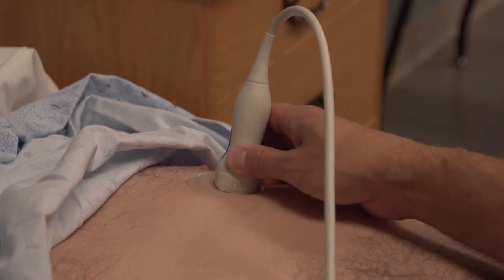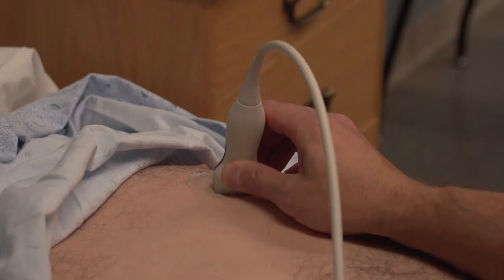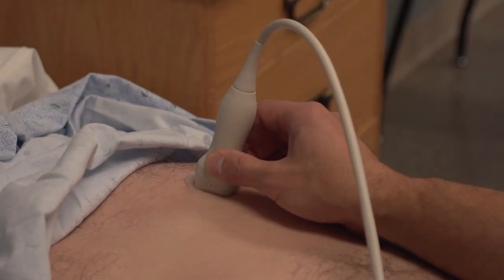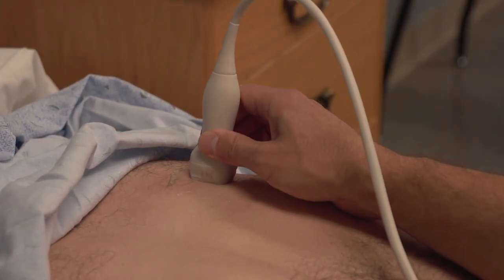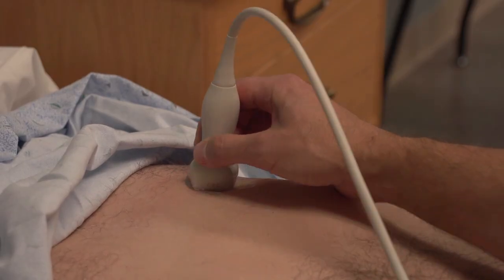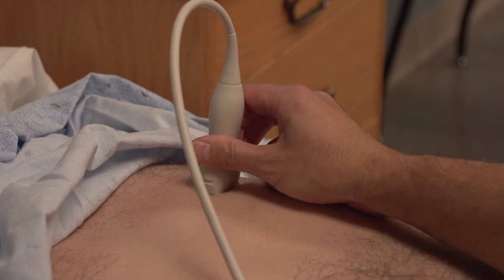With the footprint steady, you can tilt the probe, also called fanning or sweeping, to aim to a side and give a more three-dimensional view. Rock the probe cephalad or caudad, or compress the probe, pushing downward. You can also rotate the probe, which changes between longitudinal and transverse axes while keeping the target in the frame.